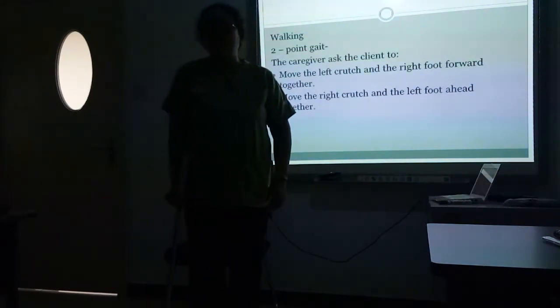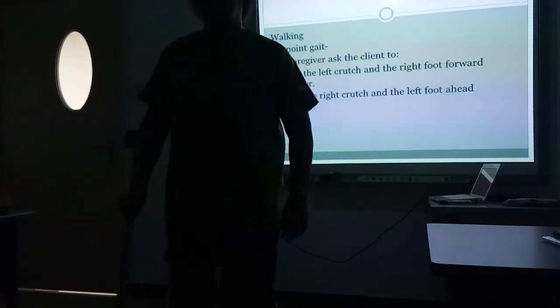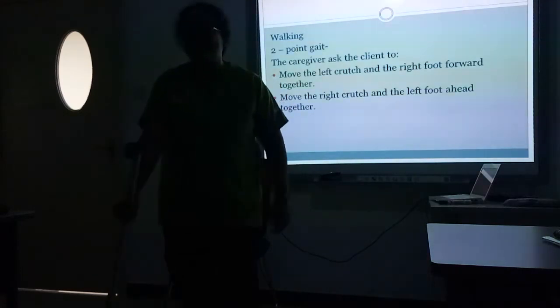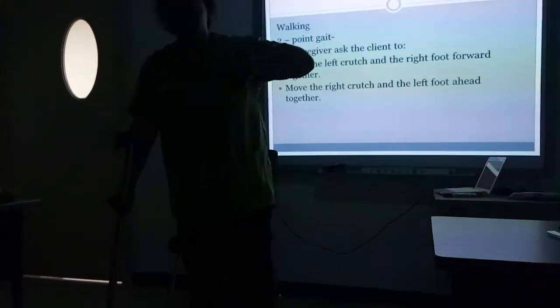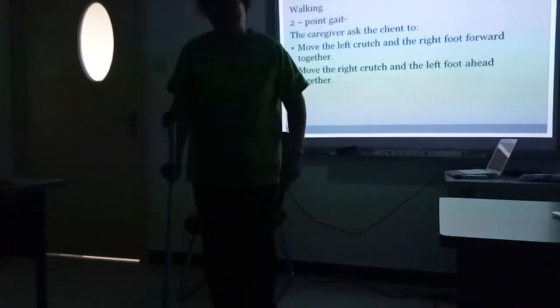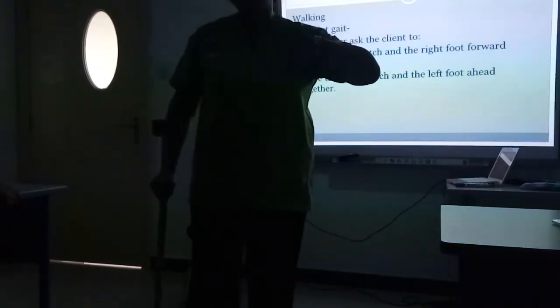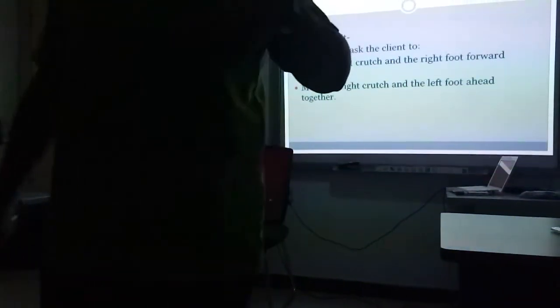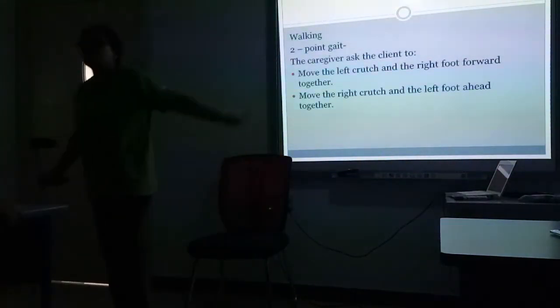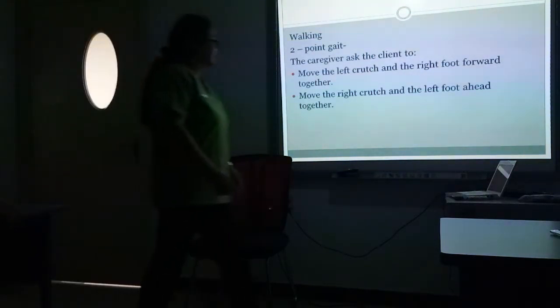Pag move nitong left, together siya. Oh, ganyan. Pero siya ay sabay-sabay. Ito, 2-point gait and 4-point gait.